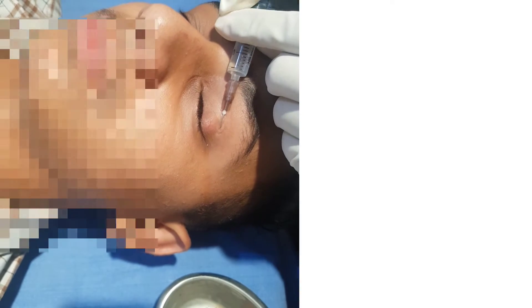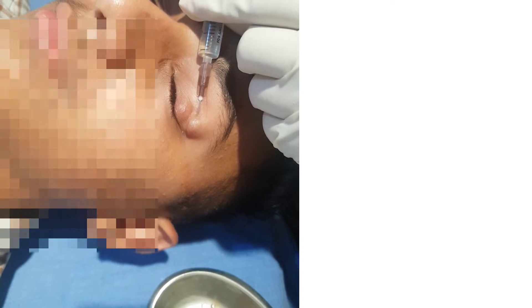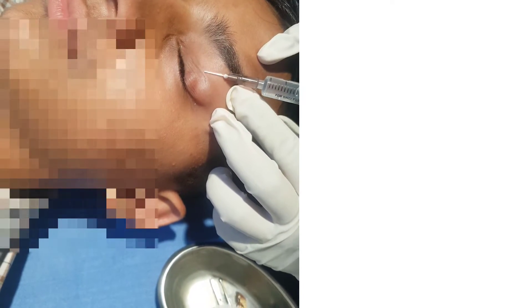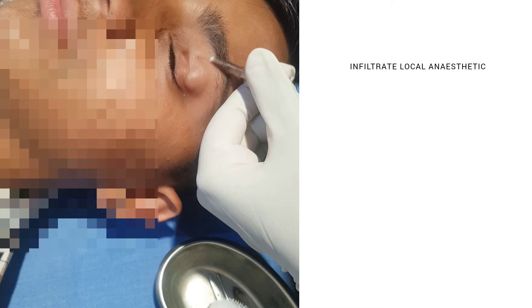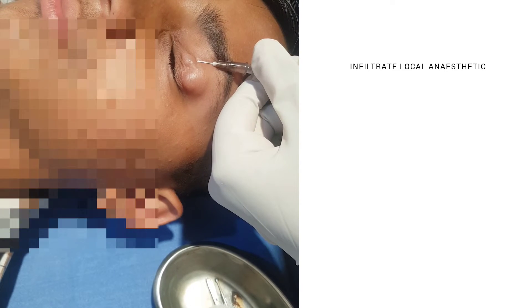As you can see, this patient has a left upper lid chalazion. The first step in chalazion removal is to wear gloves and clean the area with a spirit swab. Then we infiltrate a local anesthetic, lignocaine with epinephrine, around the chalazion using a 26-gauge needle.